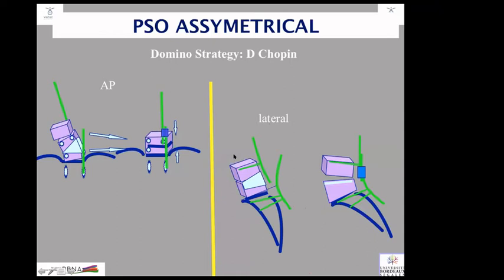So doing so, it's very important to use the domino. Otherwise, you are unable to close this osteotomy properly using only one rod. So you fix one rod on top, one rod in the bottom, and you manipulate the two rods at the same time to put them in the domino, and then apply the compression to reduce. This is the most important part of this surgery.